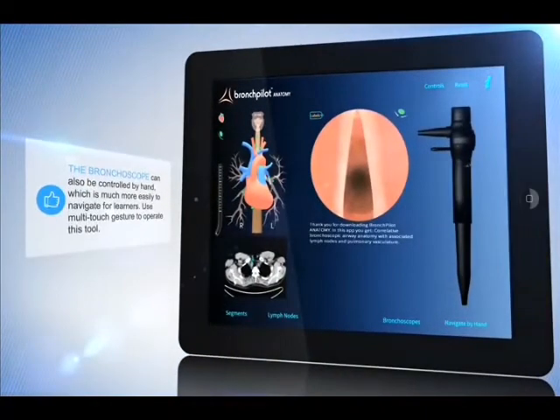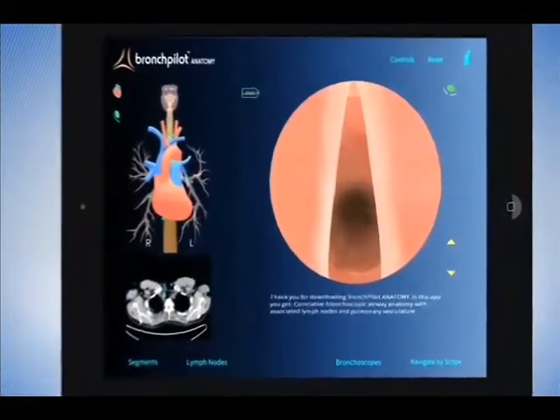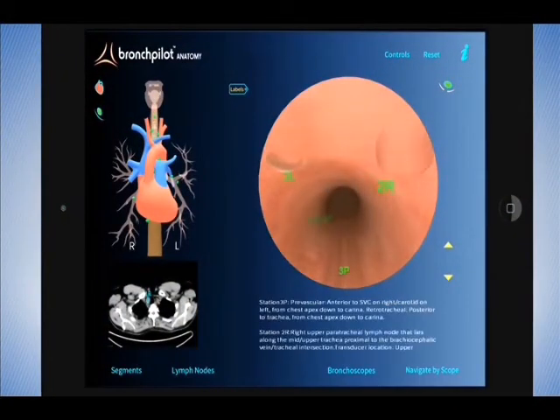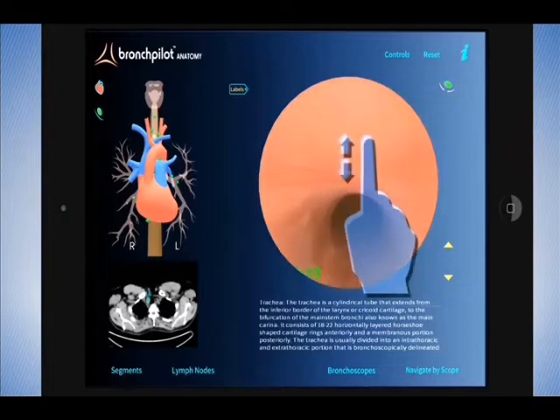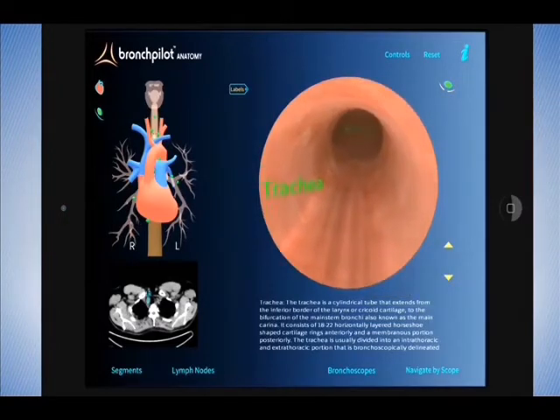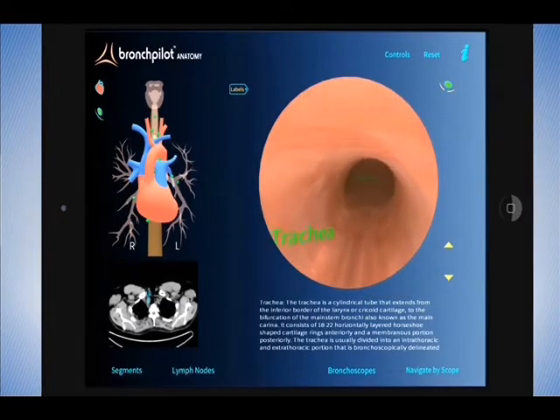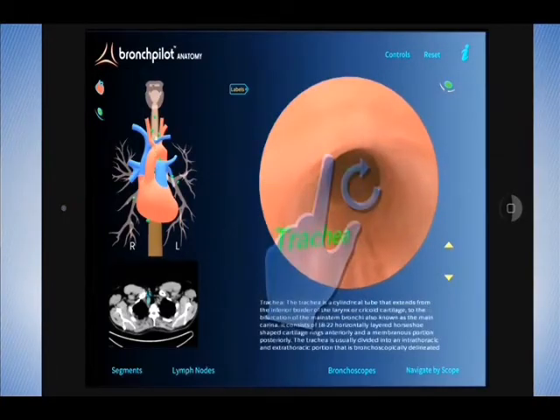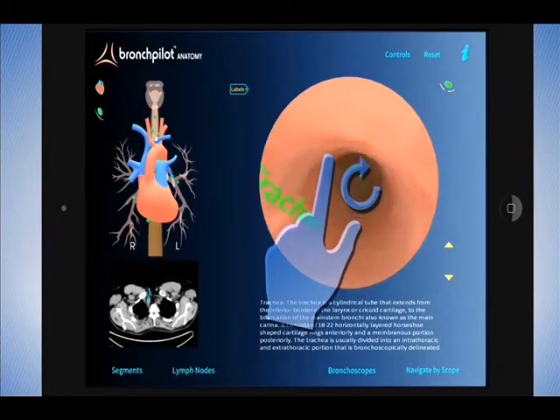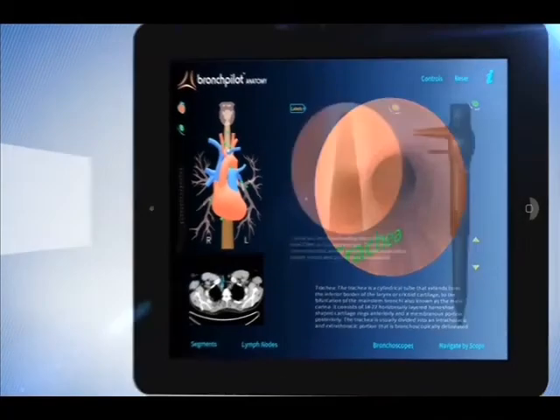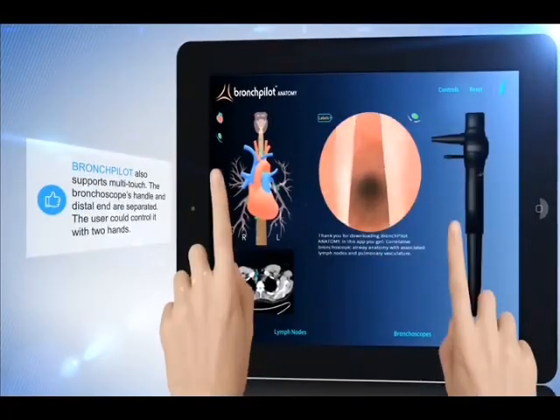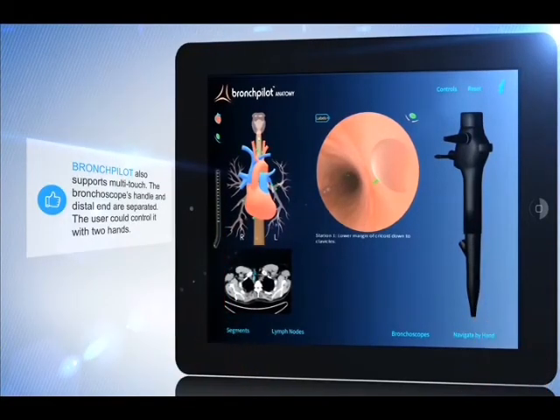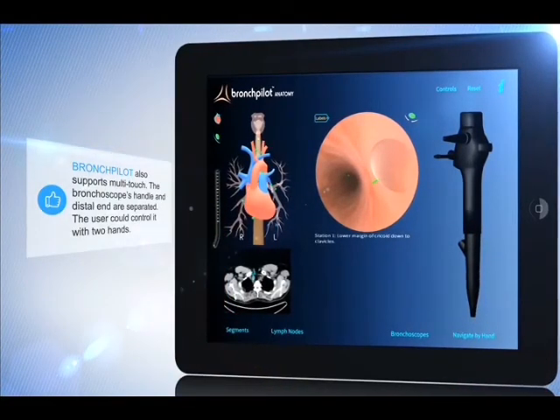The bronchoscope can be controlled by hand, which is much easier to navigate for learners. Use multi-touch gesture to operate this tool. BronchPilot also supports multi-touch — the bronchoscope's handle and distal end are separated, so the user could control it with two hands.